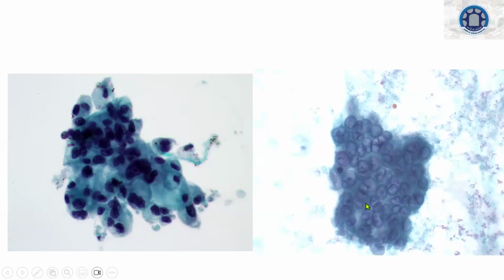And there is a mass. And it's an older male or female. What is the diagnosis? Fast. It's pancreatic ducts, which is not in a proper honeycomb, and you are seeing lot of atypia. So what is the most probable diagnosis? Fast, please. When you see ductal epithelium, pancreas mass is there. You are aspirating ductal epithelium with lot of atypia and a drunken honeycomb pattern. What is the diagnosis? And I'm telling you it is malignant.